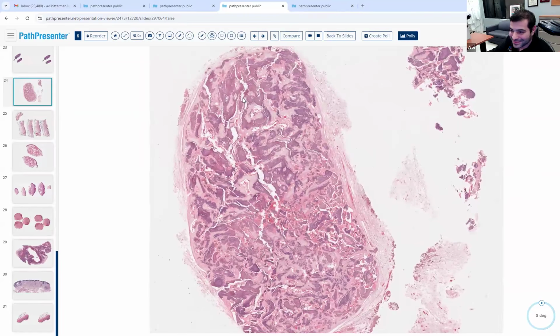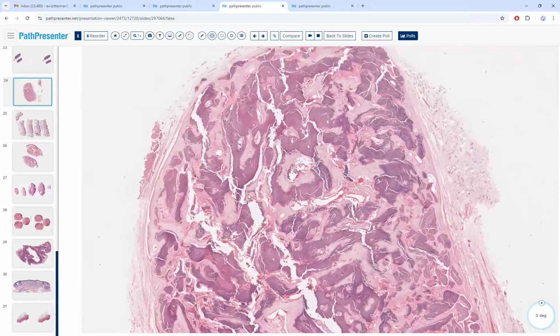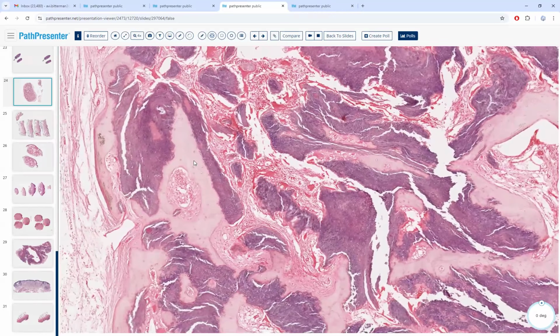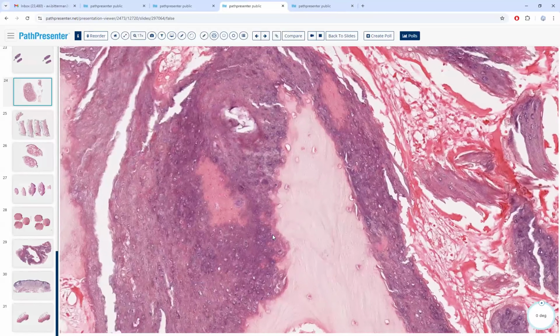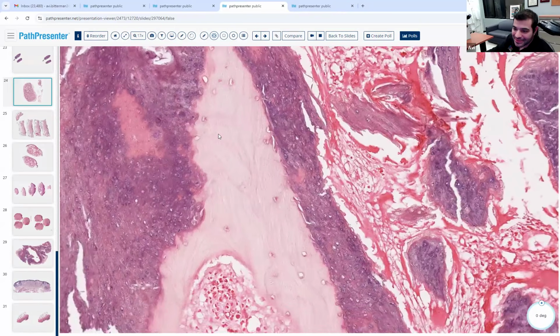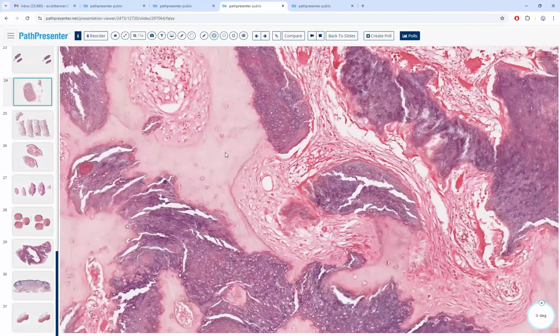And this one? There's a lot of cracking of the tissue. I feel like that pale pink. Actually, is that hyaline cartilage? Like, is this a mixed tumor? Well, you tell me, is this hyaline cartilage? It looks like chondroid. I mean, to me, I don't know.